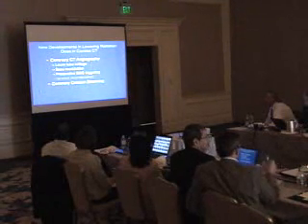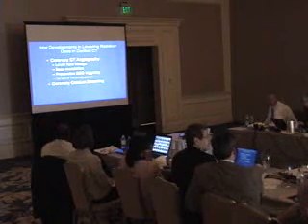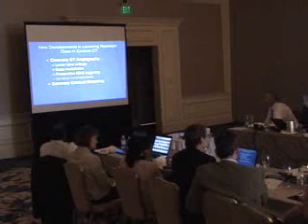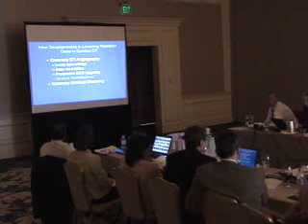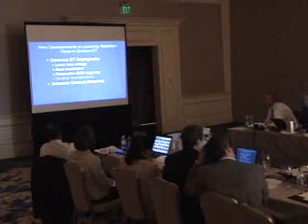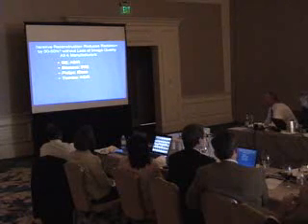Everything I talked about dealt with what's called filtered back projection as a way of handling the CT data. It's been known in the tomographic world, in SPECT, PET, CT, that iterative reconstruction is a superior way of getting information from CT. It allows you to have fewer photons or fewer data entry points and end up with images of similar quality. So iterative reconstruction is going to reduce by 30 to 50% the amount of radiation associated with coronary CT angiography.